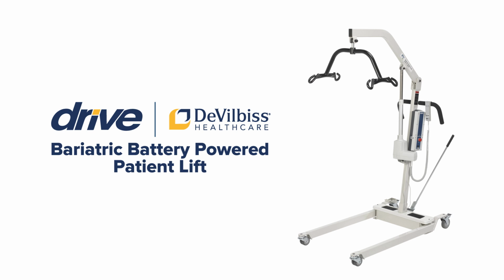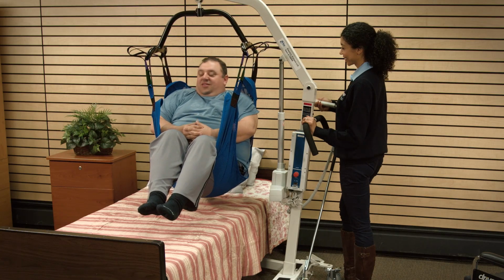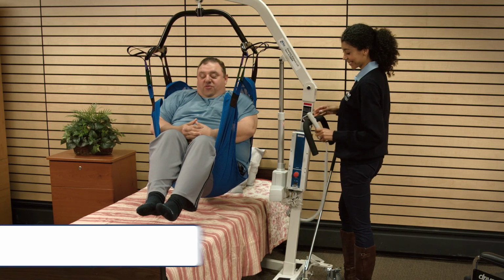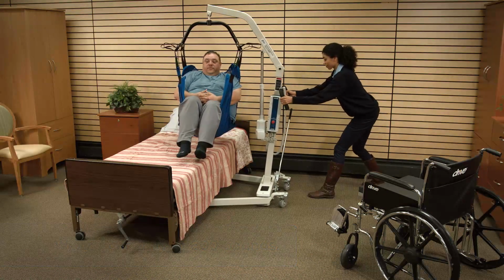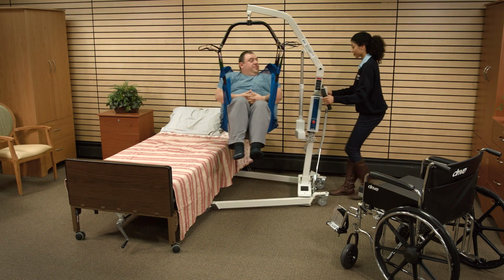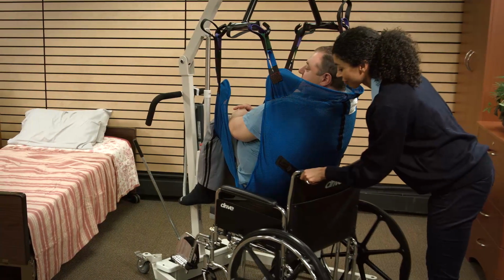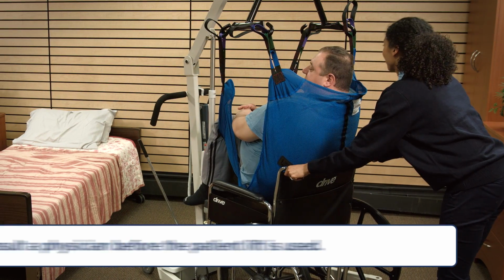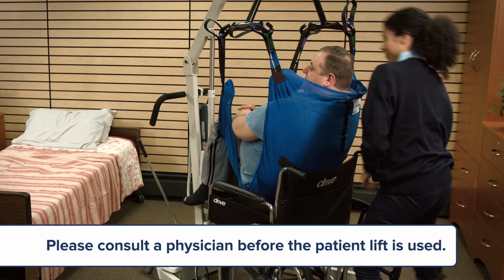This video will enable you to successfully operate the Bariatric Battery-Powered Patient Lift, which is designed with a weight capacity of 600 pounds. The lift allows a medical professional or attendant to comfortably and safely transfer a patient from one resting position to another. Safety is most important when using a patient lift. Your safety, as well as the patient's safety.